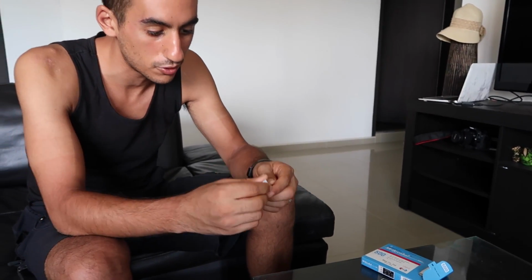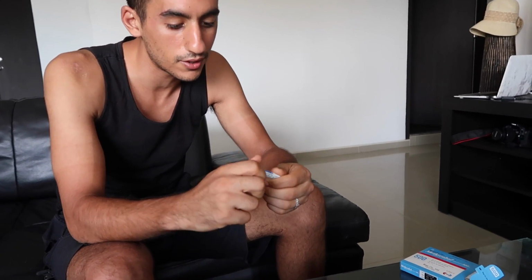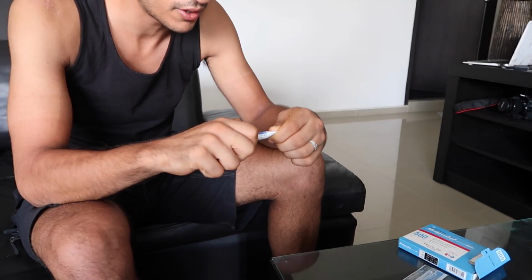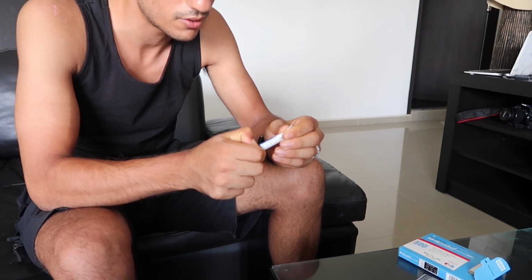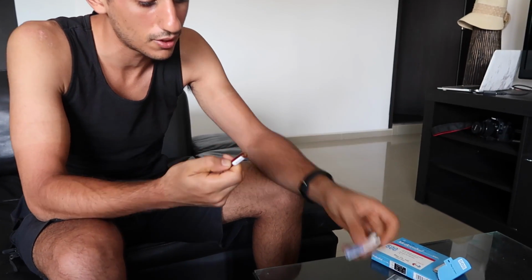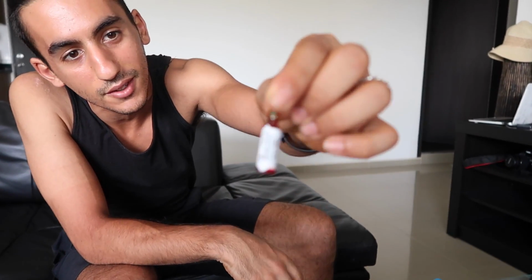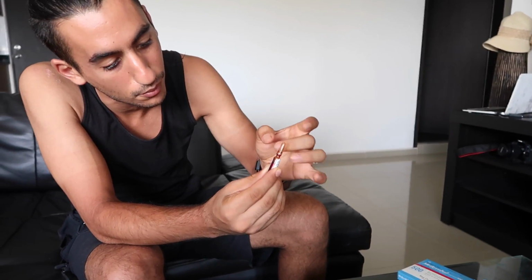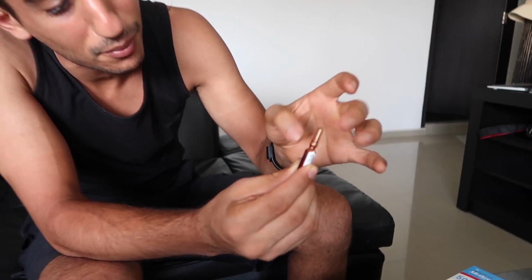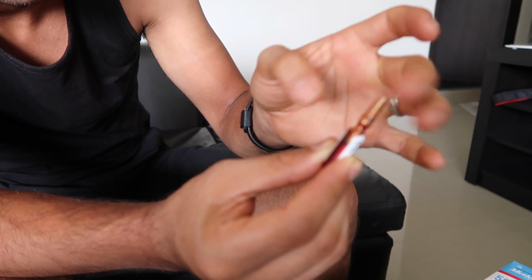We have the B12, which is here, and to open it, there's a little slit here, just twist it and then rip it off. It comes like this, just pull the actual vial out slowly. Try not to break it. And this one's stuck. There you go, done. So it comes in a little vial like this. This is methylcobalamin. It's kind of a red liquid, you can see. You normally have a little bit at the top, so hit it a bit, make sure all of it comes down to this bottom bit.